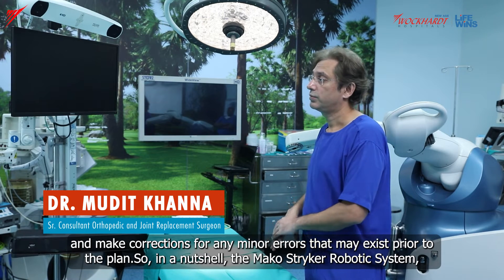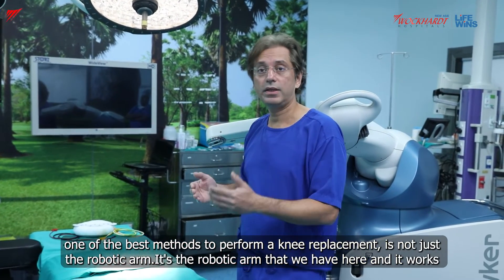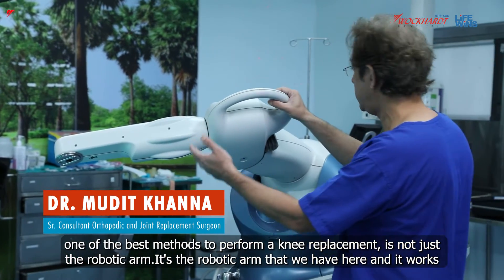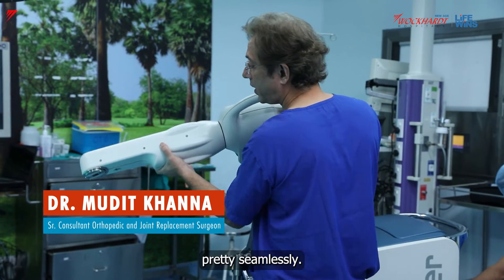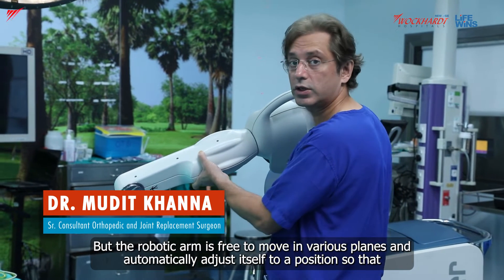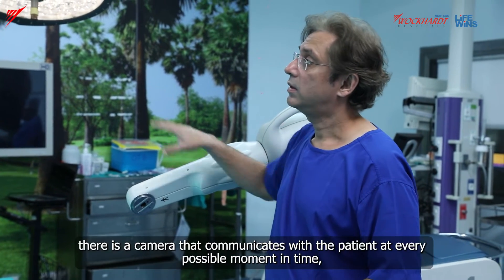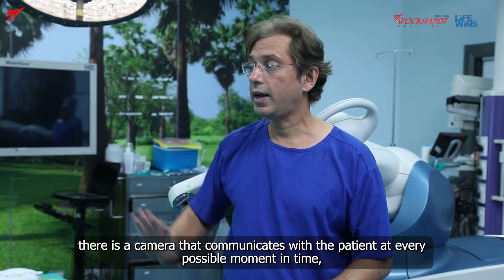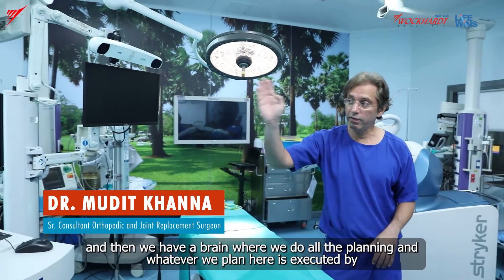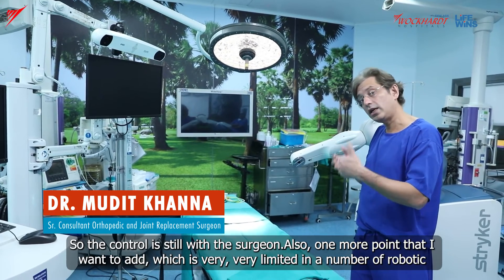In a nutshell, the Mako Stryker robotic system — one of the best methods to perform a knee replacement — is not just the robotic arm. The robotic arm works seamlessly and is free to move in various planes, automatically adjusting itself to achieve the best cut. Besides the robotic arm, there is a camera that communicates with the patient at every moment, and then we have a brain where all the planning is done. Whatever we plan is executed by the robotic arm with the help of the surgeon, so the control is still with the surgeon.